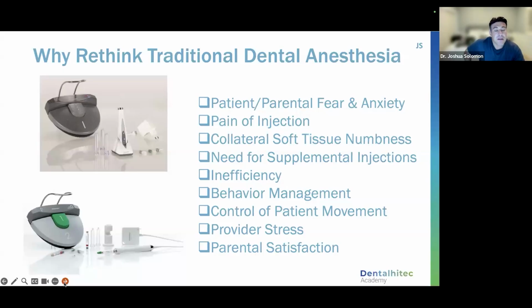And these devices also give you flexibility in your schedule, because someone asked about patient flow. Here's the thing. Now you've got options. You can anesthetize and start work right away. You can anesthetize, go do some checks, and then come back. Or if you are adding treatment on, you can immediately anesthetize the other quadrant and get started working.